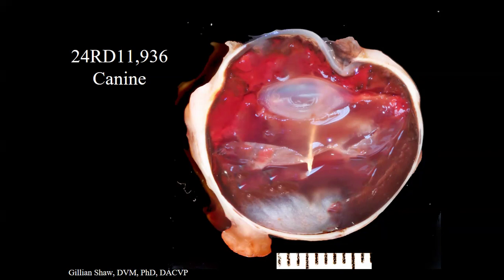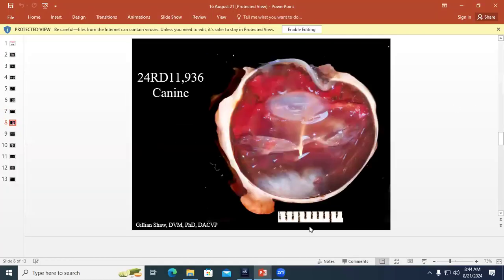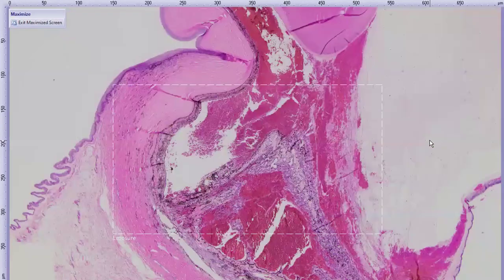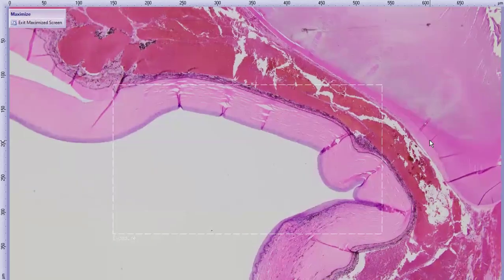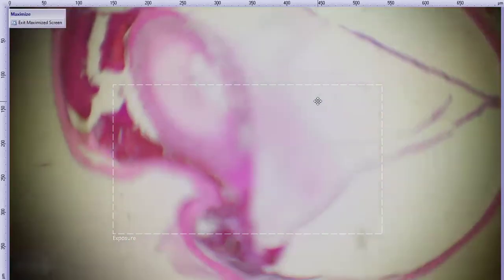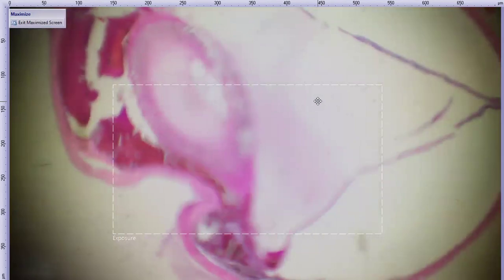And I think I was very quickly reviewing cases in my flat to decide if I needed deepers or special stains or anything. And I just didn't really pay much attention to this case at all until I really sat down to write everything. And I was like, oh, well then. Here is the cornea. And oh, I could go, let's do that. That's more fun and exciting. So cornea is to the left. Oh gosh.